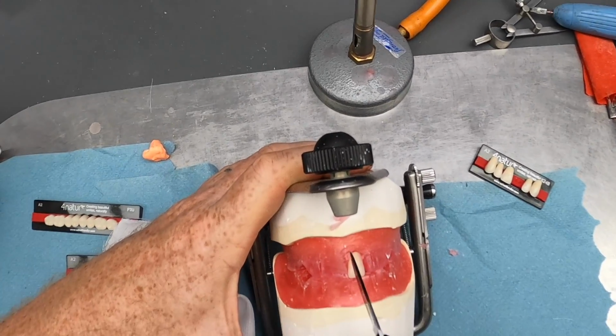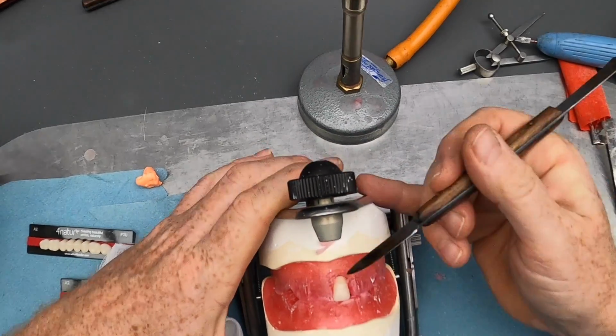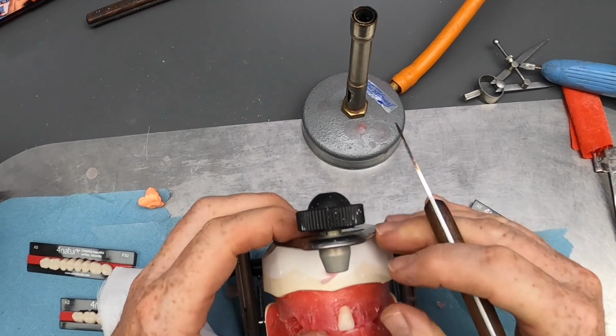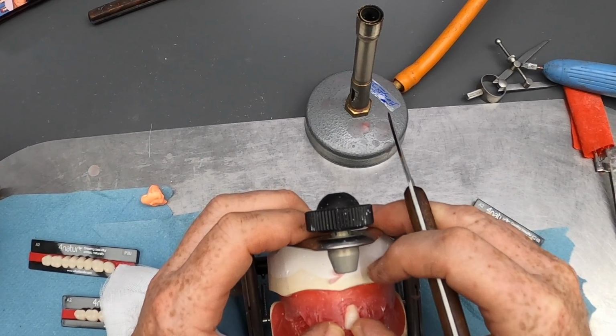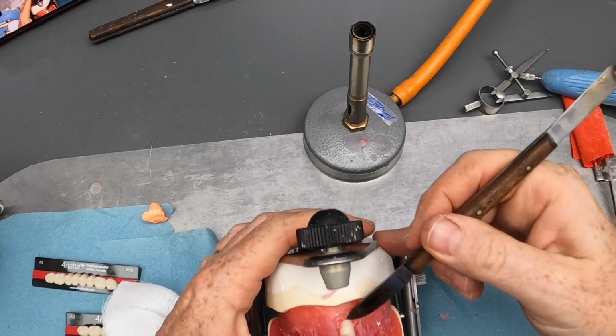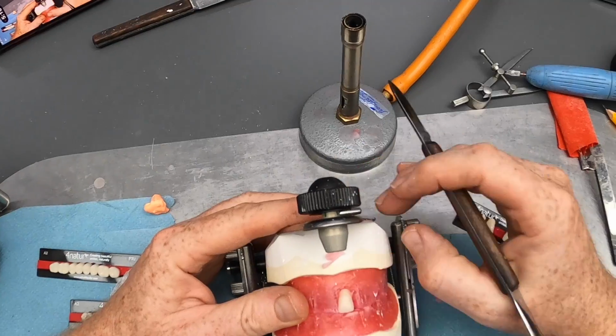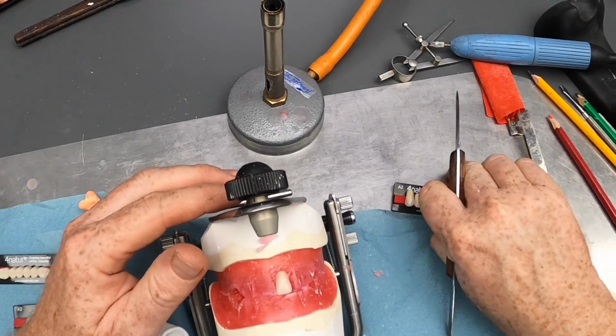So you can see I've got the long axis of the tooth pretty much vertical, maybe around a little bit more, with the incisal edge parallel to the occlusal plane and on the occlusal plane, and the neck of the tooth slightly in, so it's going to sit where the natural tooth was originally.